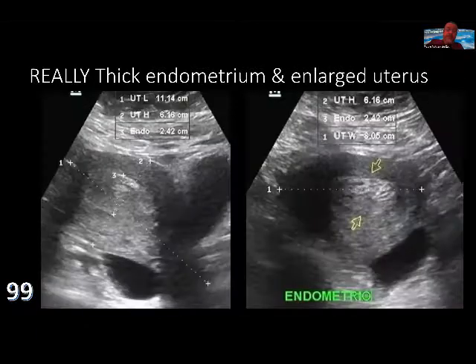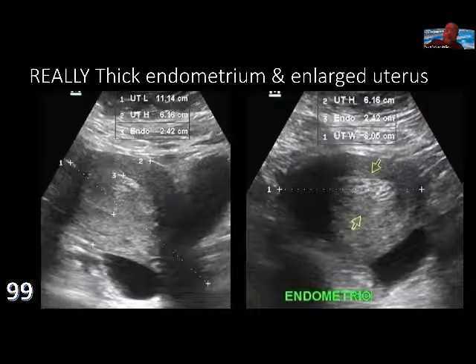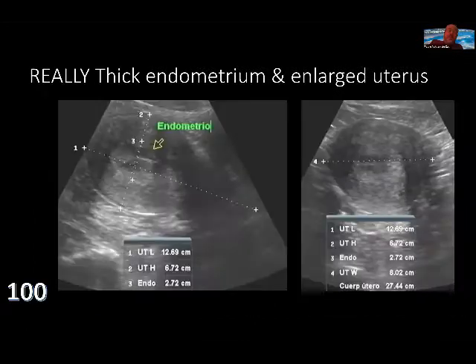Biopsy. Similar to that. One more, really thick endometrium, almost 3 centimeters width.